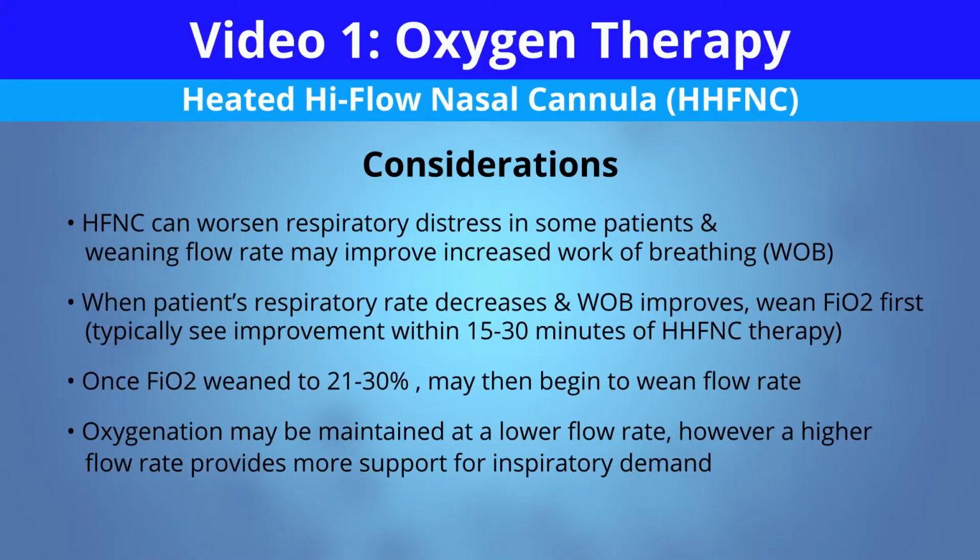If you're happy with your setup and you are at a point where you want to start weaning your patient, as their respiratory rate, their heart rate, and their overall clinical status has improved, the first thing that we would like you to do is wean the FiO2. And weaning the FiO2 should start in increments of 1 to 3% or as high as 5% at a time. And then what you want to do is, again, always go back to your baseline assessment and assess how they're responding to your changes in FiO2.